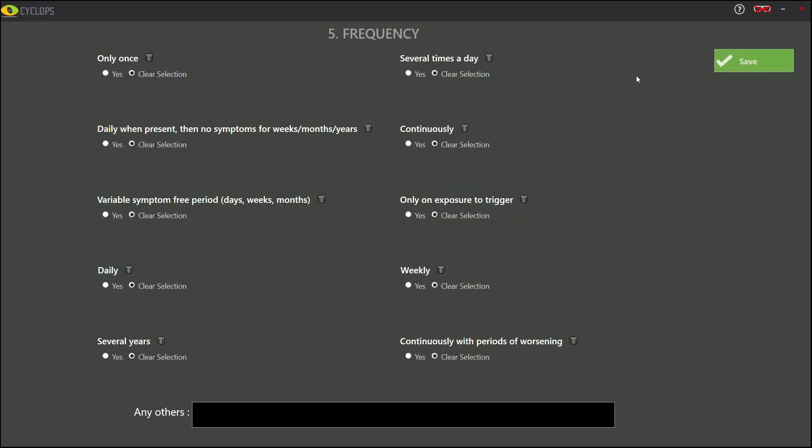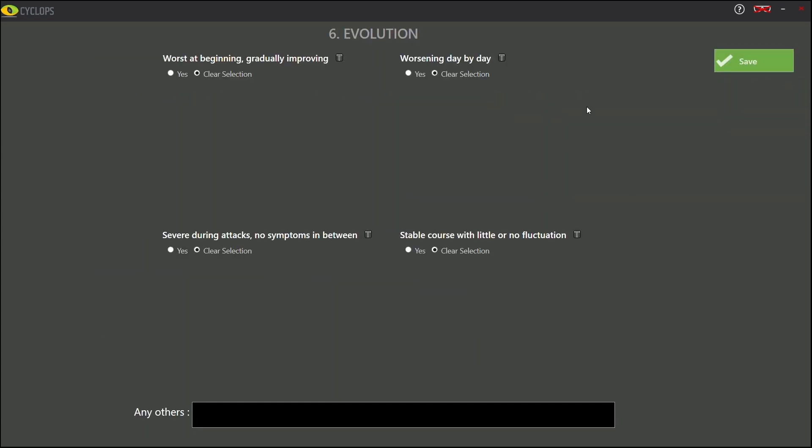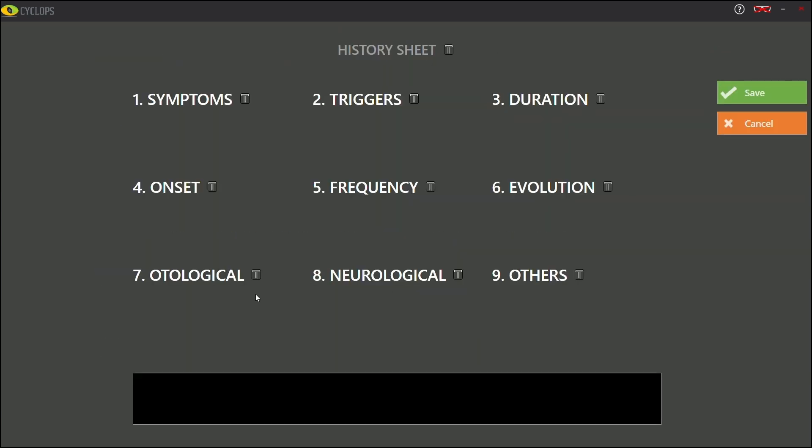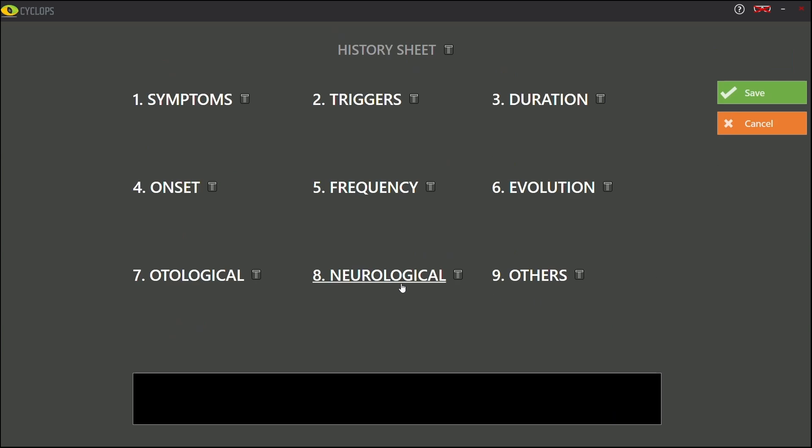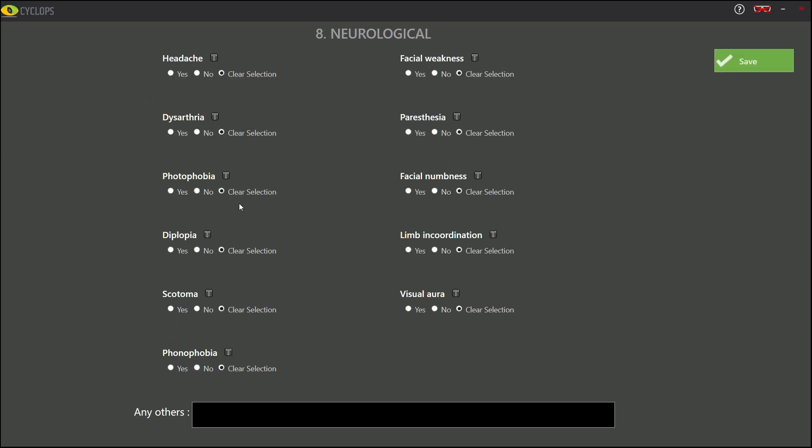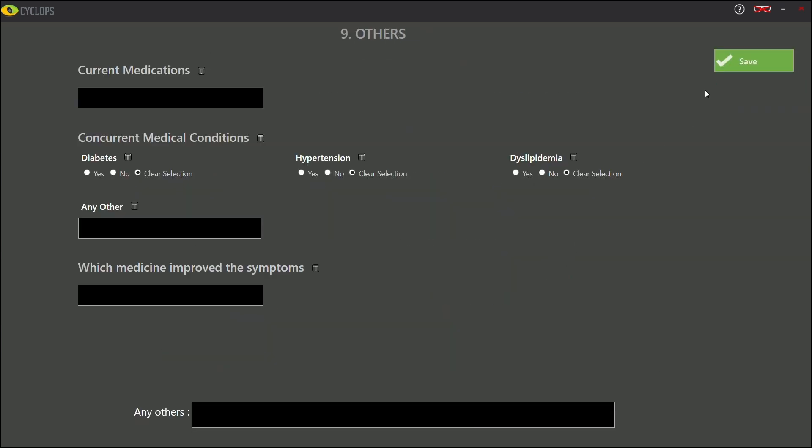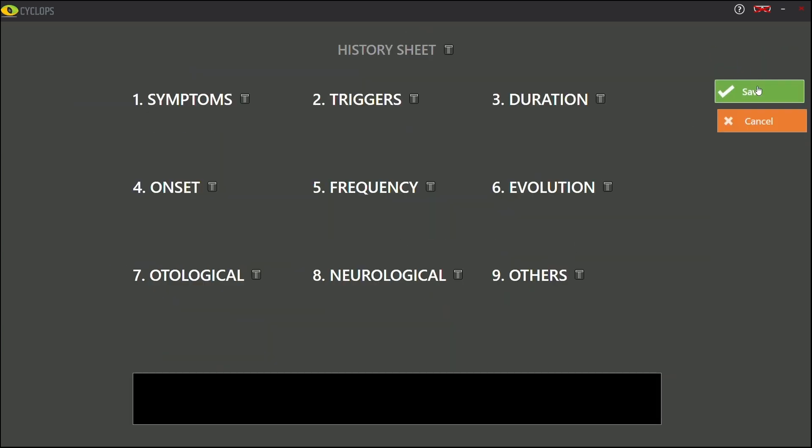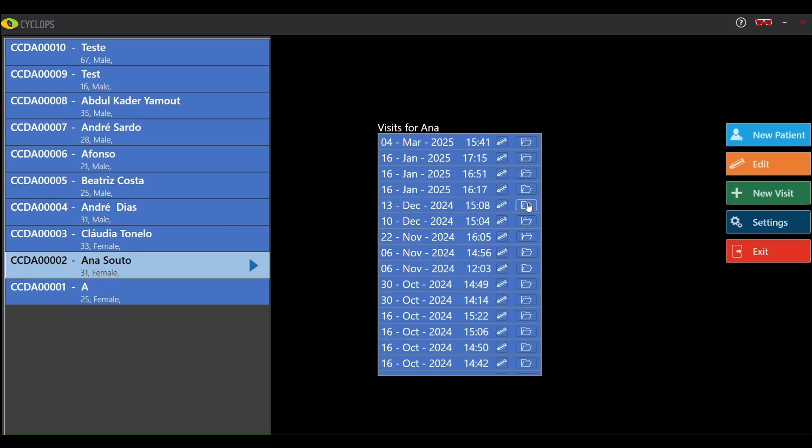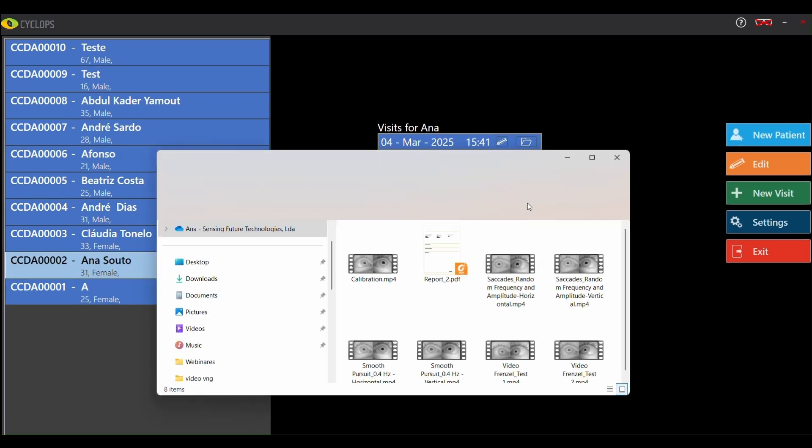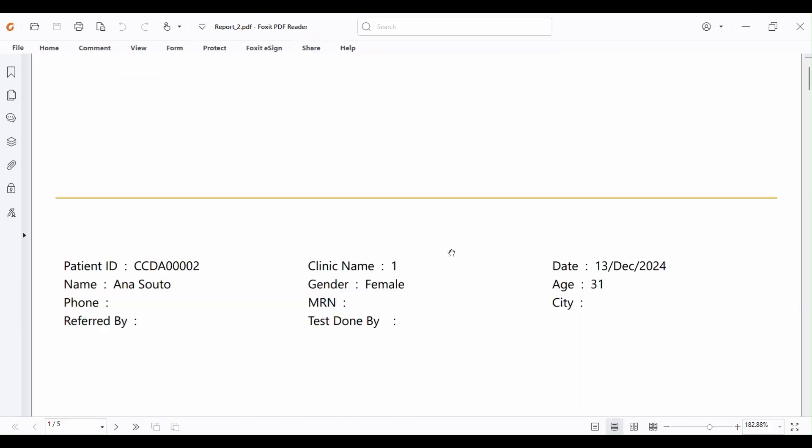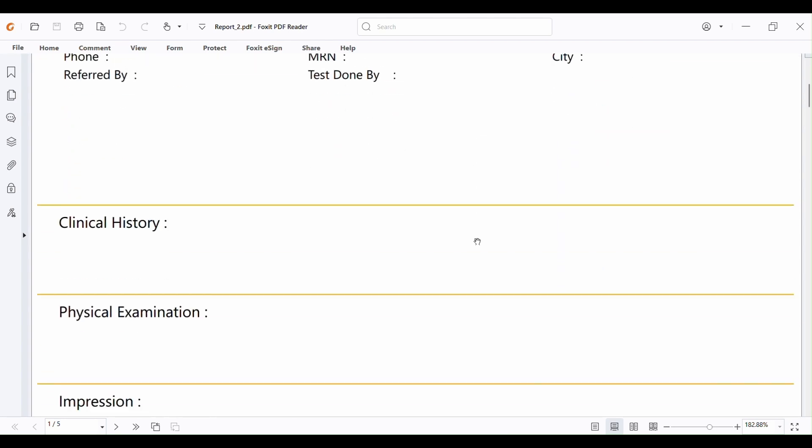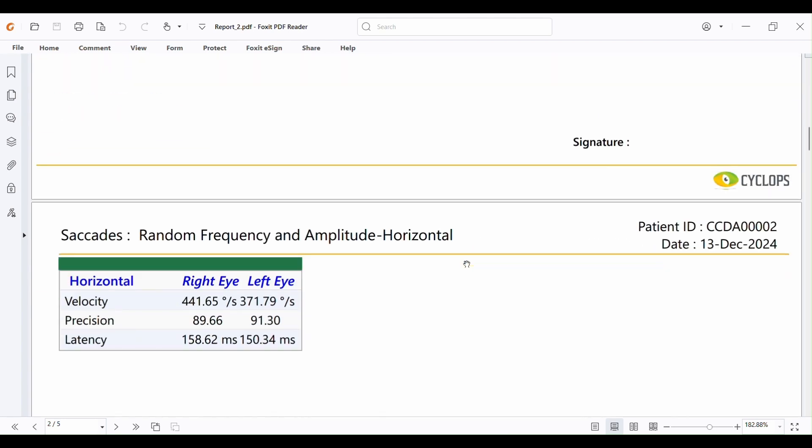Including synchronized video, eye movement graphs and event markers. Once testing is complete generate detailed PDF reports with customizable comments and trace selections. All data from video recordings to diagnostic graphs is securely stored under each patient visit for future reference and comparative analysis.